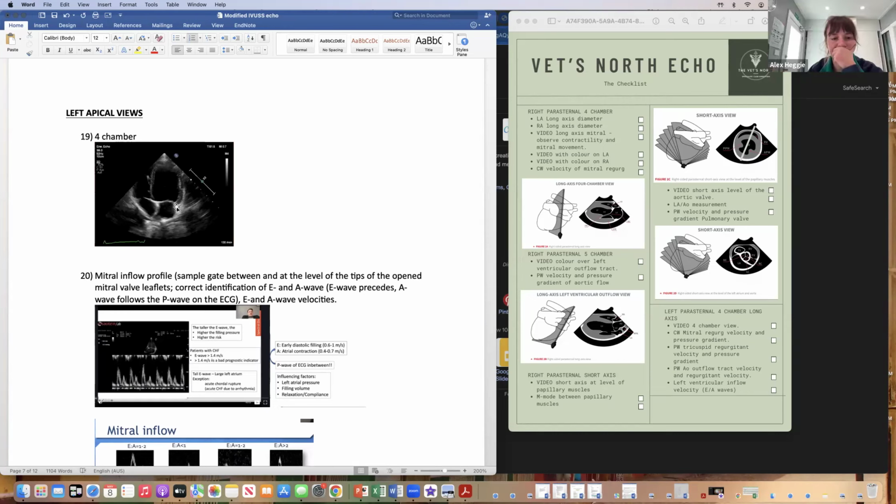It just never looks this good. Don't wait for this image to pop up, but do try and get it as much as you can. And remember that the angle is the key to getting that, because there's no way you're going to get it from side on.